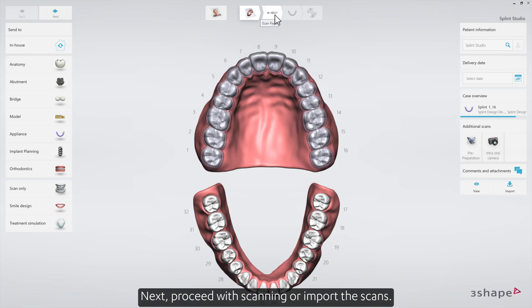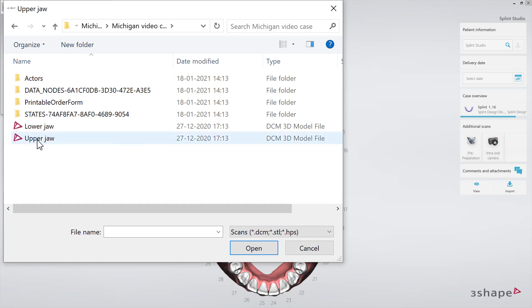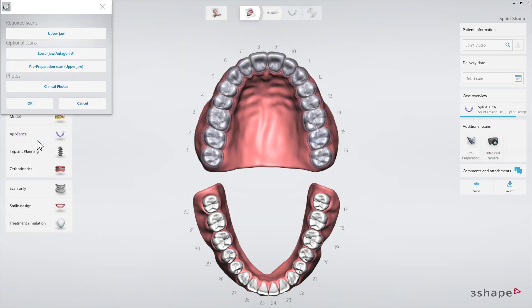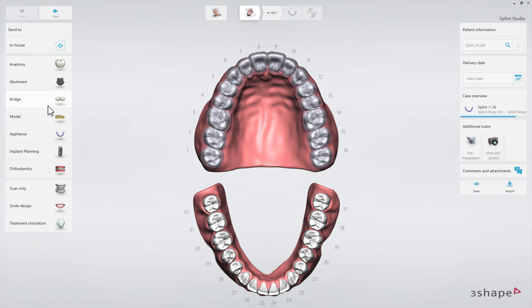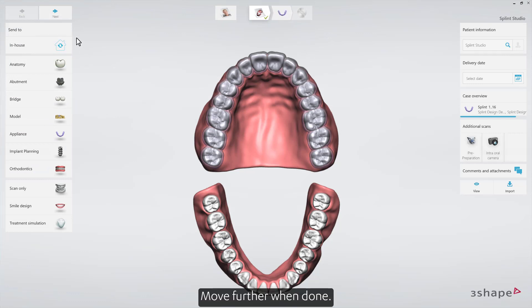Next, proceed with scanning or import the scans. Move further when done.